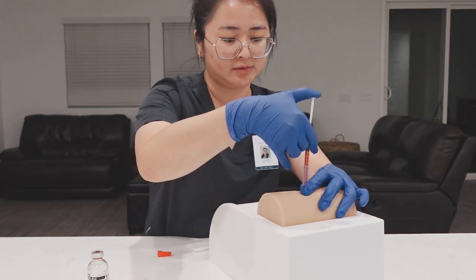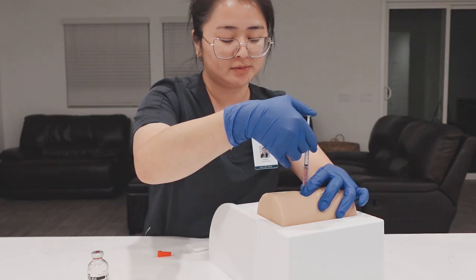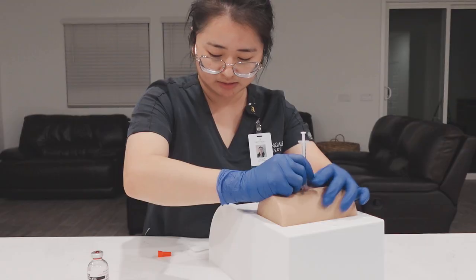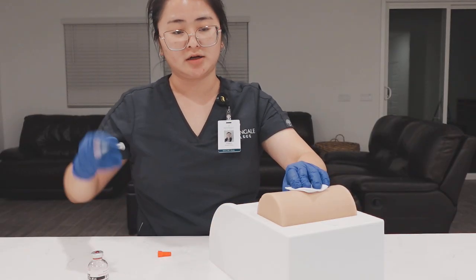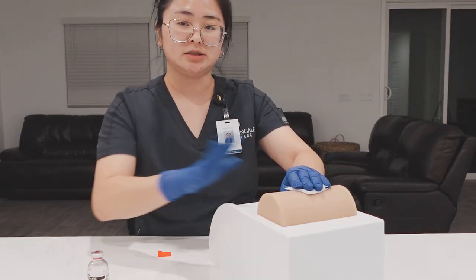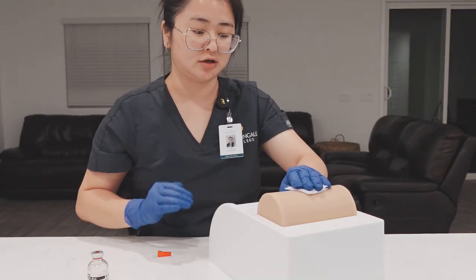Now that it's been injected, we're going to hold it and administer it slowly, approximately over 30 seconds. Okay. We're going to hold it, get the gauze, and place it gently over, making sure that there's no bleeding. We're going to dispose of this in the sharps container. And we're going to make sure that the gauze is over gently. We're not going to massage or put very forced, hard pressure onto the area.